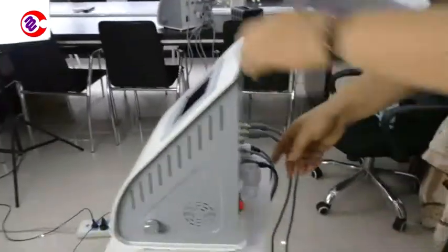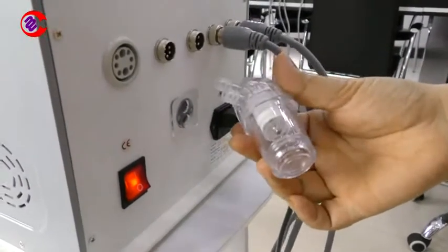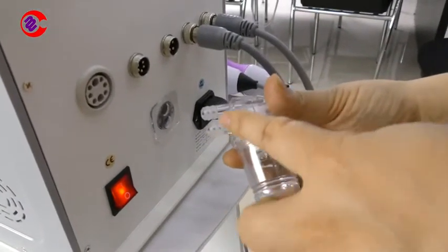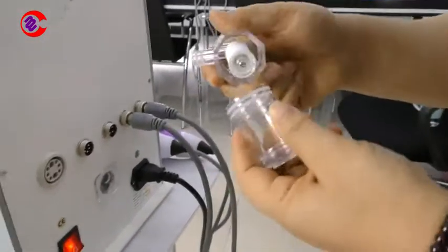Firstly, it's very important here — this is the vacuum filter. Make sure this seal ring is here in good condition, and the seal here is also in good condition.